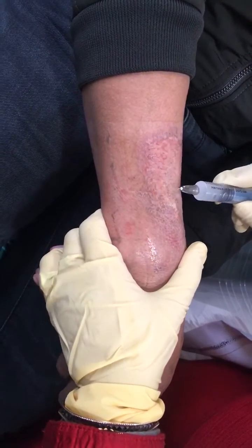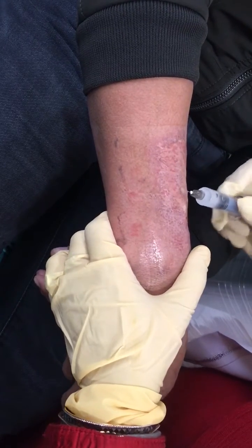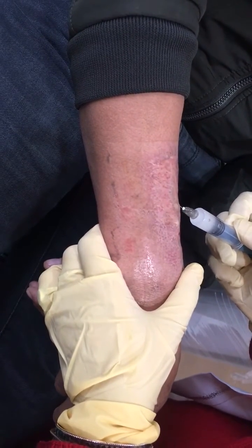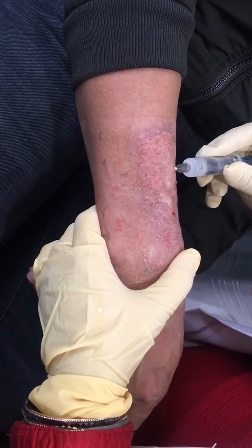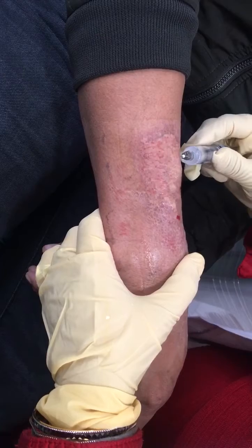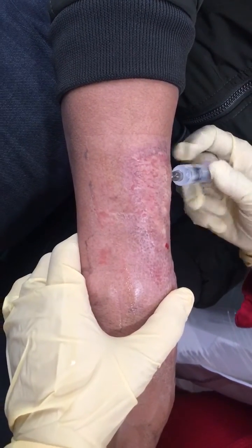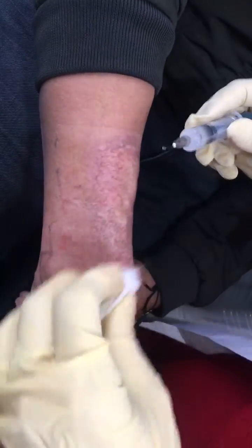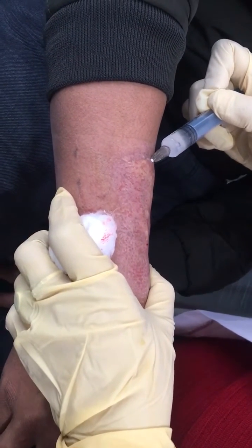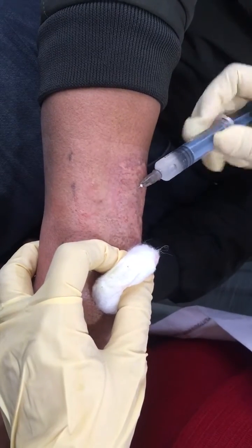If you have pain in your skin, you will tell me, okay? I am withdrawing and pushing the solution at multiple places just to be sure that we are not anywhere in the vessel — comfortable in all the hypertrophic tissue.